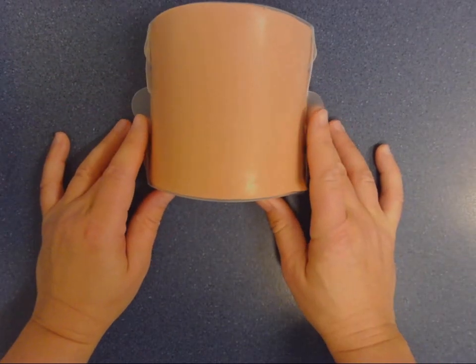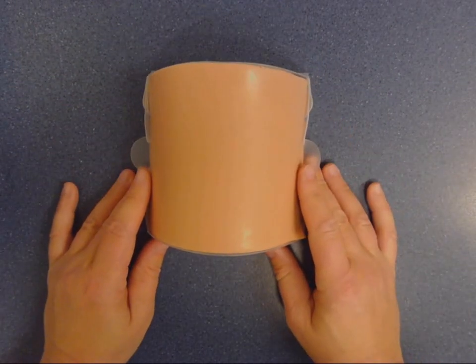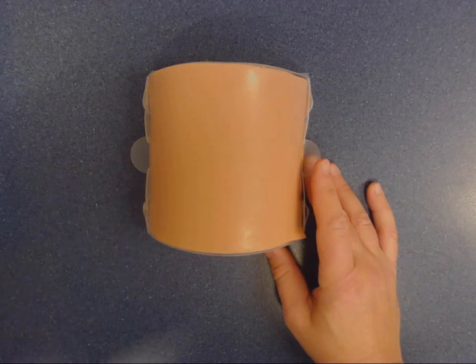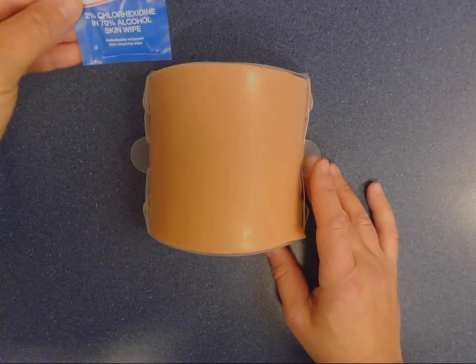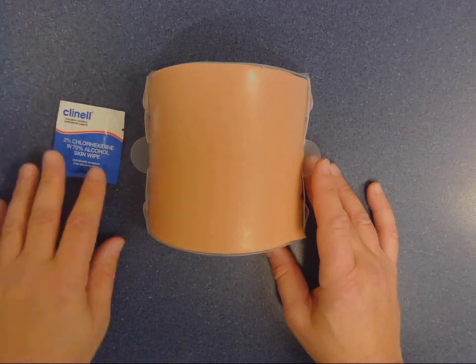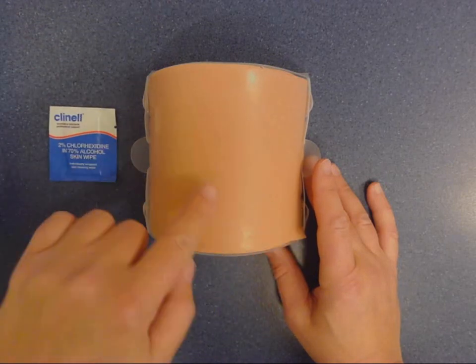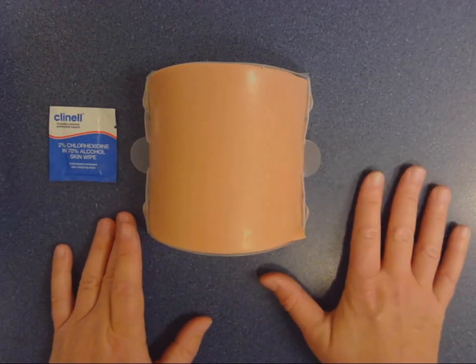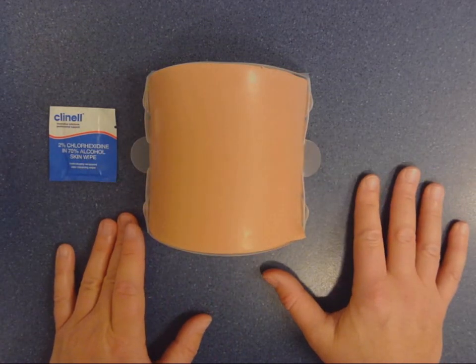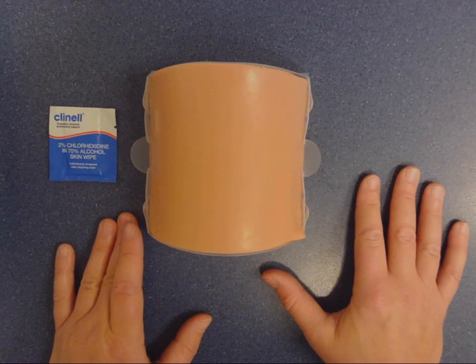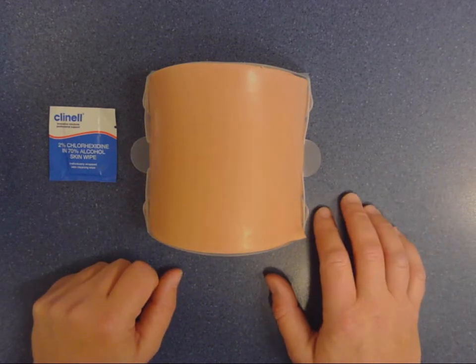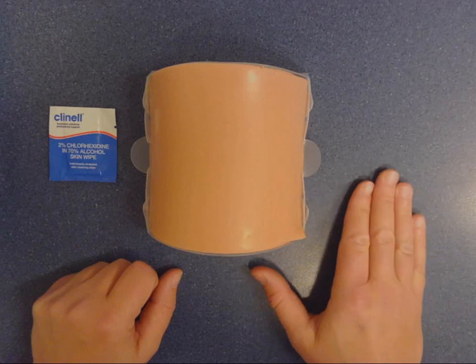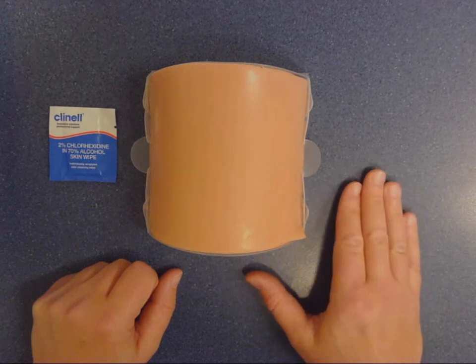If the skin is visibly dirty, we'll clean the skin with a Steret or an alcohol wipe. We clean the skin for 30 seconds in a circular motion, and then we let the skin dry for 30 seconds, which allows the alcohol to evaporate and take away all the bugs that are on the surface of the skin. But if the skin is visibly clean, then we don't need to prep the skin with the alcohol wipe.